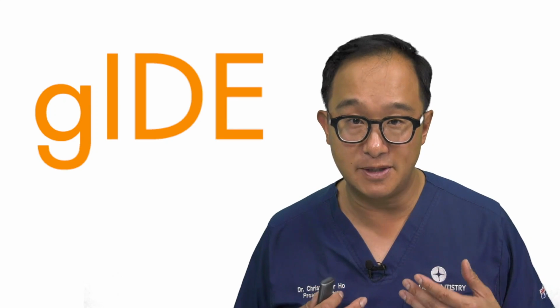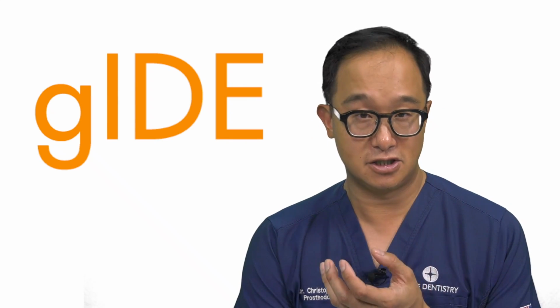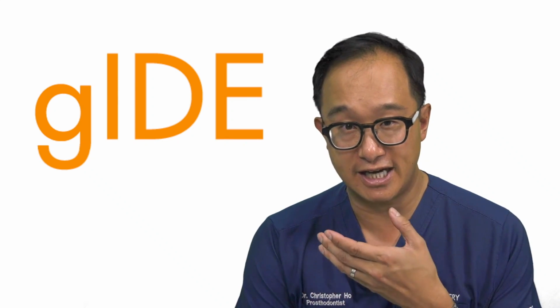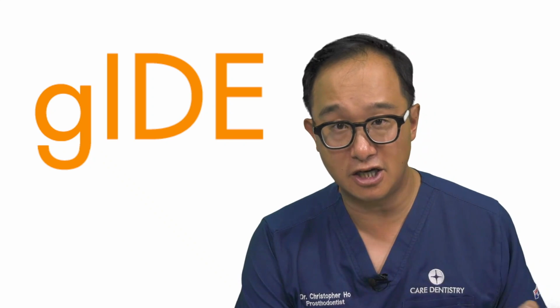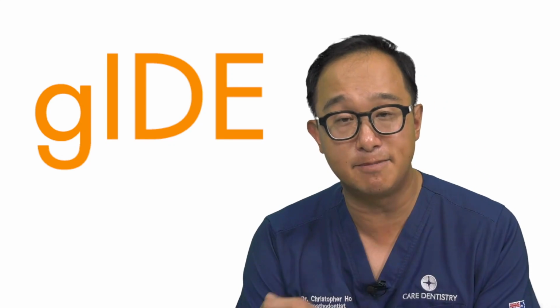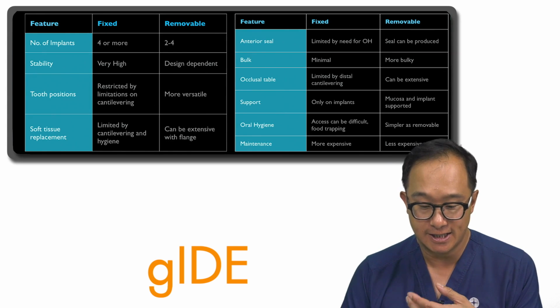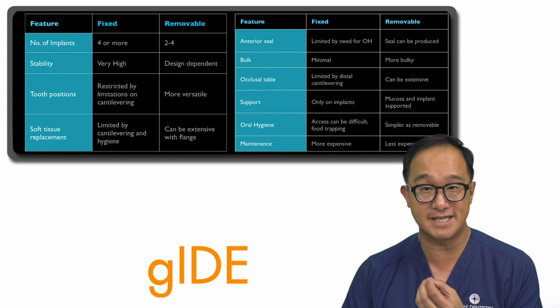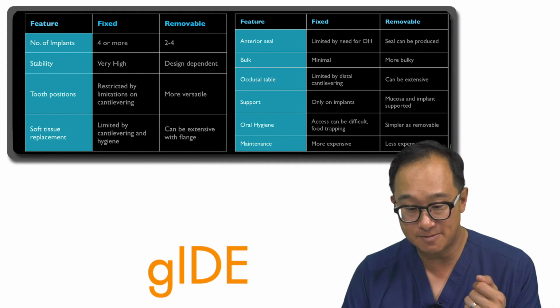And also you can provide more lip support by having a flange. In cases where you have excessive loss of bone and soft tissue, you may need to use a flange, and in a case like this where you have a flange to support the lip, the patient can still clean effectively because as they remove the overdenture, they can access the bar and clean it correctly. Now, looking at the seal, a removable overdenture can seal a lot better than a fixed prosthesis. Some patients may have trouble with fixed prostheses. They may have some bubbling as they speak, especially if you've created too much space underneath a maxillary prosthesis.